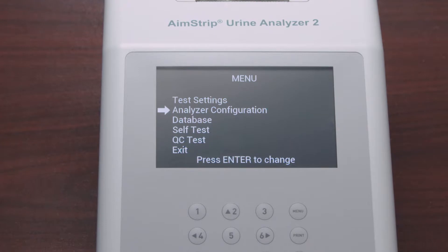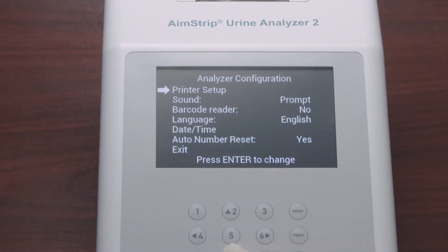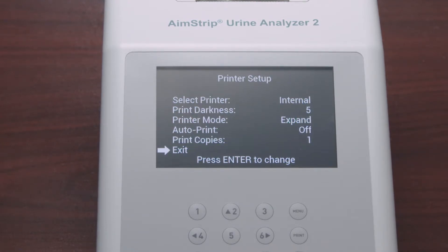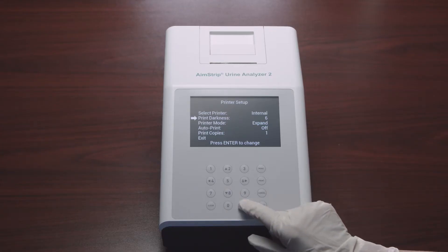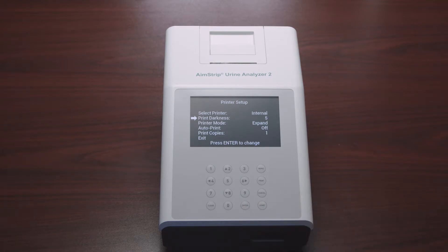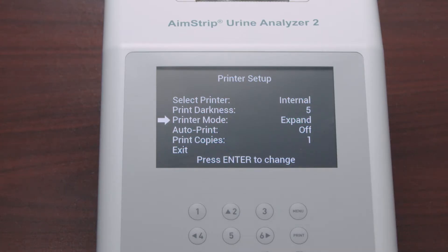You can configure your analyzer by selecting Analyzer Configuration and pressing Enter. Select Printer Setup to navigate through the printer properties. Choosing Internal in Select Printer prints results on the internal printer; External prints on an external printer. The next option is Print Darkness, which ranges from 1 to 9 — the darkest is 9 and the default is 5.